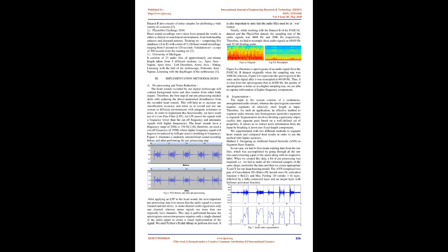3. University of Michigan. It consists of 23 audio files of approximately 1 minute length taken from 4 different sections, i.e., apex area, supine; apex area, left decubitus; aortic area, sitting, listening with the bell of the stethoscope; pulmonic area, supine, listening with the diaphragm of the stethoscope.